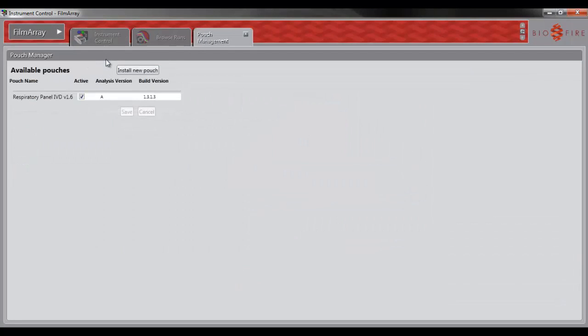This pouch management page shows you what software pouch modules you have loaded on your system. As you can see here, I have the Respiratory Panel version 1.6 loaded. I will be installing the Respiratory Panel version 1.7 pouch module, but follow the same steps to install any pouch module you would like.